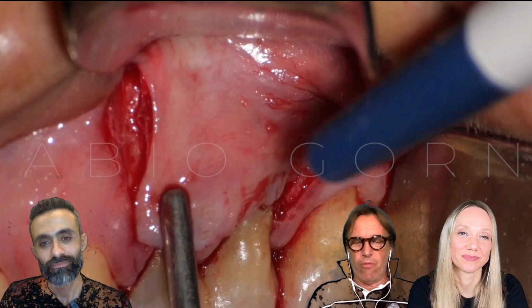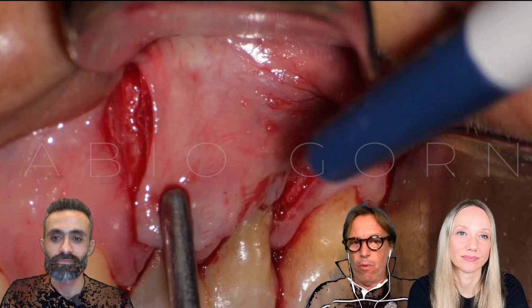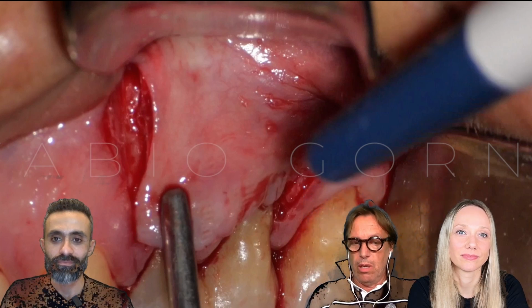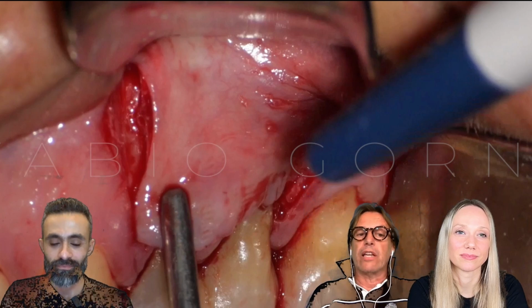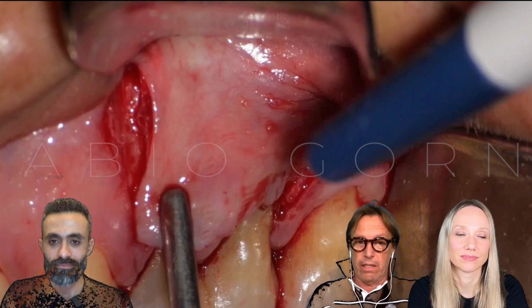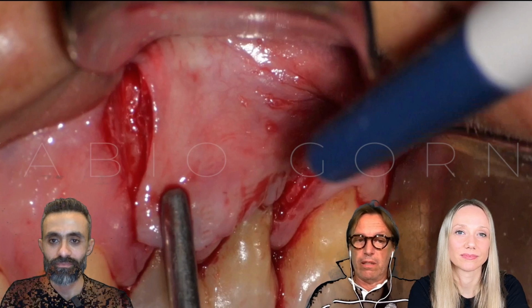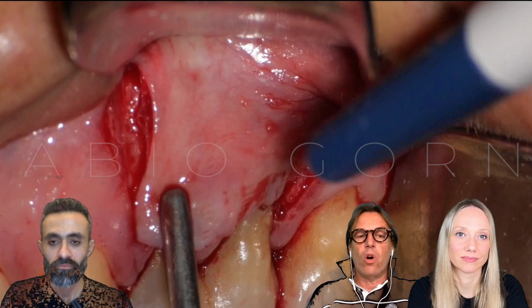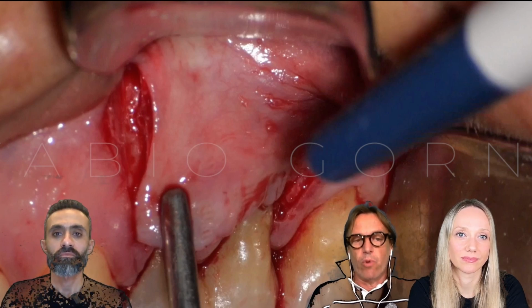Besides, what kind of material are you using? I prefer, for example, to use MTA compared to bioceramic putty because with the MTA I can condense it, and at the end I'm sure that the retrofill will be three-dimensional. I don't want any void inside of my retrofill.